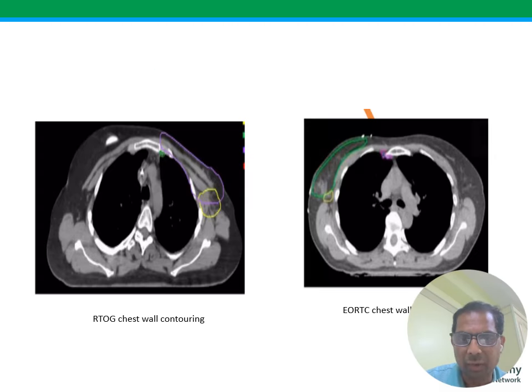So again, talking about the chest wall contouring. So we talked about that before we talk about conformity. The contouring of supraclavicular is important because the dose to esophagus would matter and how you expand would matter. And contouring of chest wall is important because then again dose to heart and lung would matter. So it's important that you standardize this in a practice so that everybody is consistent in treating increased or decreased volume from inter-patient individual variations.